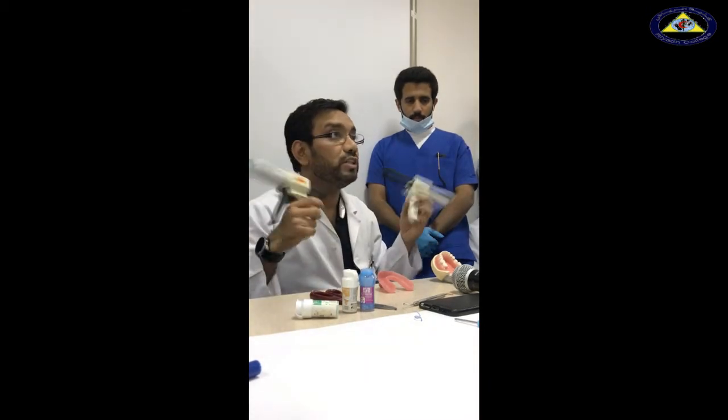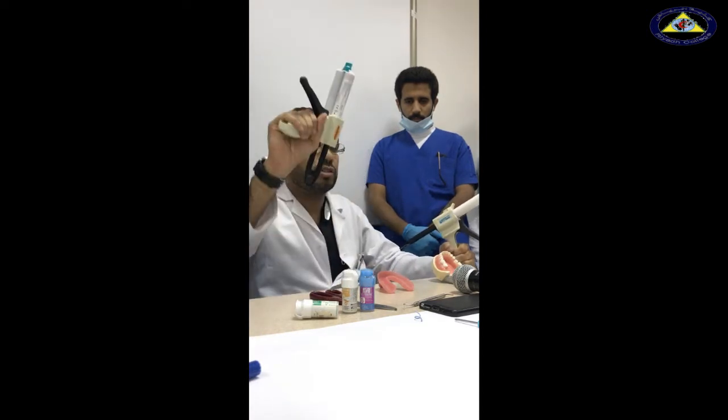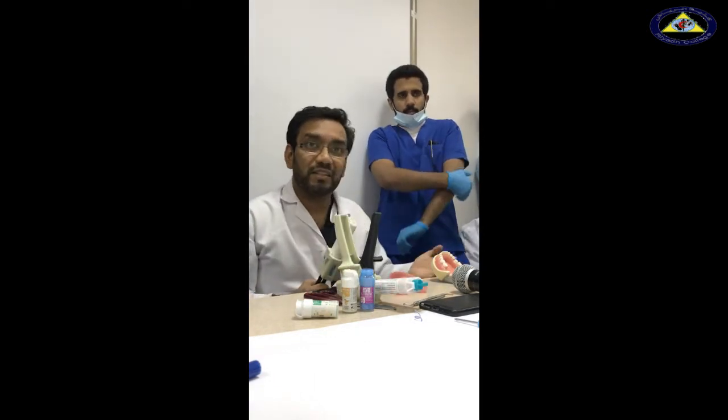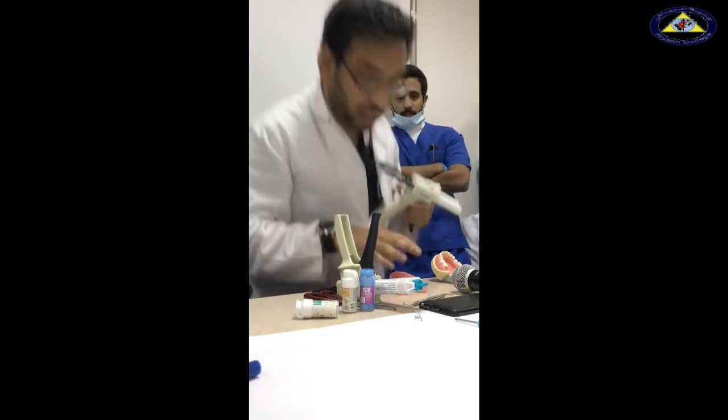Which one do we inject on the tooth? The light viscosity is going to go on to the tooth structure, and the heavy viscosity is going to go in your tray. In this technique, you need four-handed dentistry. You are going to have an assistant and a clinician. The clinician always works on the tooth and the assistant works on the custom tray.